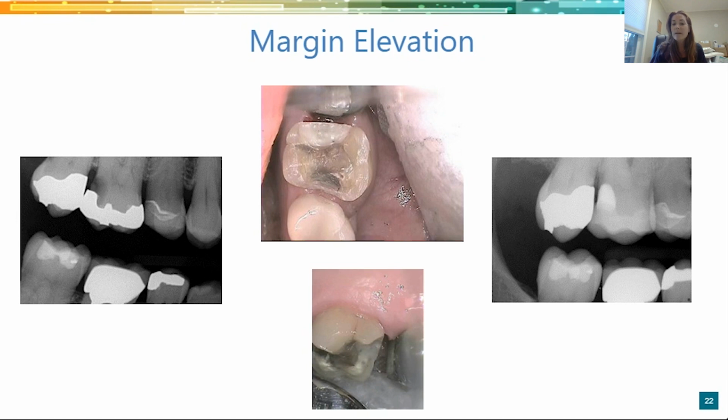So I would so much rather put this restoration in and not have to worry about aggravating the tissue interproximally between 2 and 3. I can see my restoration without any blood or saliva or anything getting into my cement, and then potentially not getting a good seal or getting recurrent decay underneath my crown.